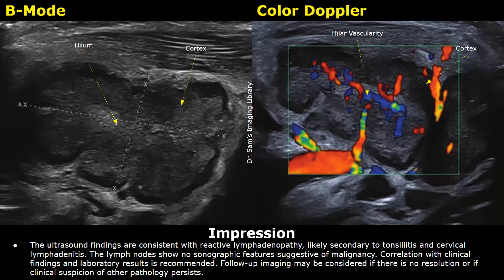The impression: the ultrasound findings are consistent with reactive lymphadenopathy, likely secondary to tonsillitis and cervical lymphadenitis. The lymph nodes show no sonographic features suggestive of malignancy. Correlation with clinical findings and laboratory results is recommended. Follow-up imaging may be considered if there is no resolution or if clinical suspicion of other pathology persists.